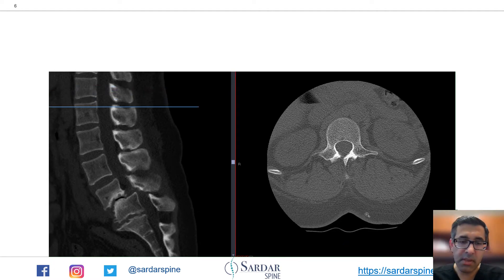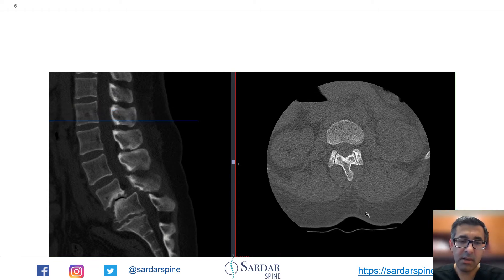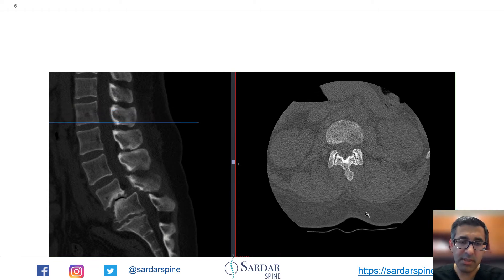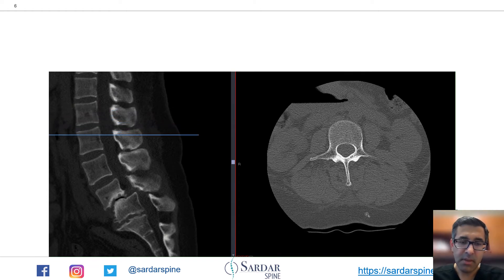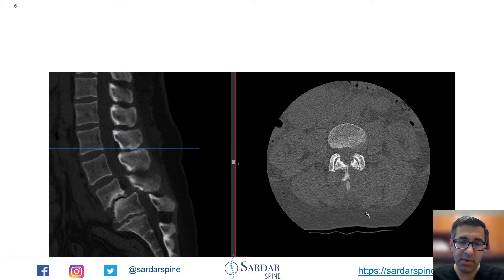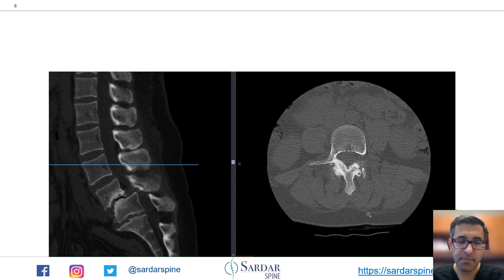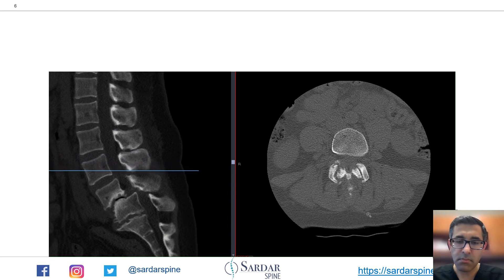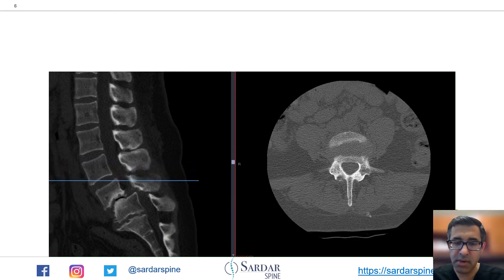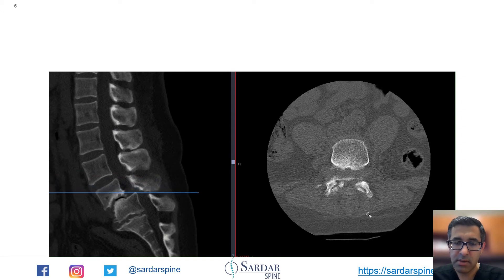Even in the supine position for the CT scan, the spondylolisthesis reduces a little bit, but it's still between almost grade 2 to grade 3. You can see the facet hypertrophy shown here on the axials and erosion at L4-L5.